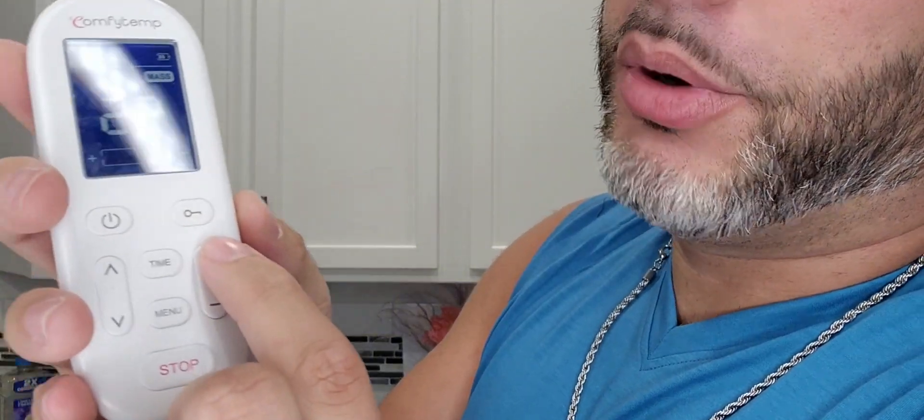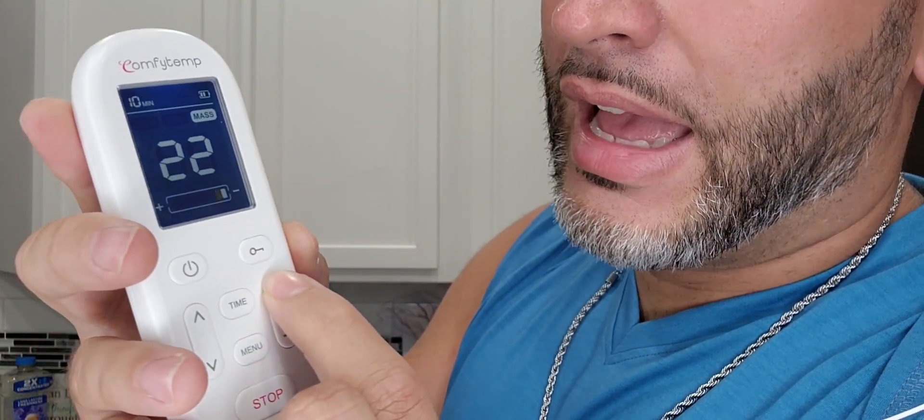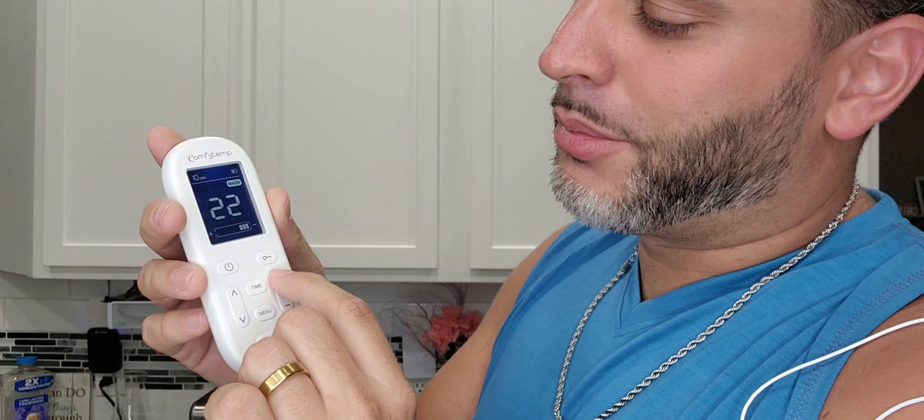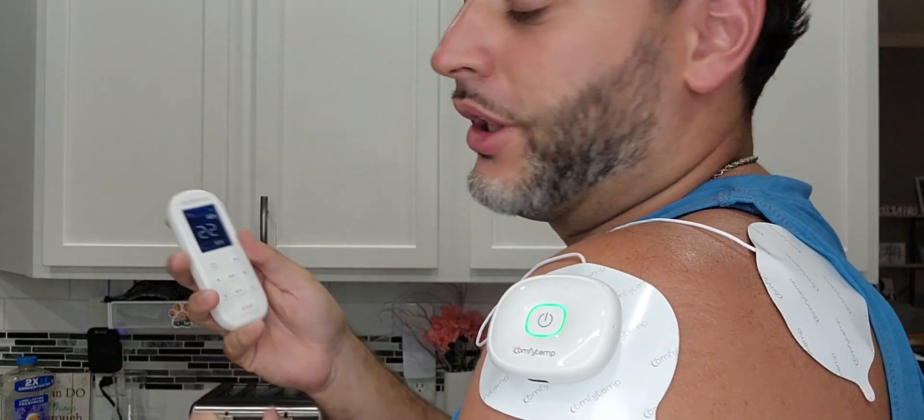Now we're going to hold down that power button. Right away it'll say 'CC,' meaning it's just connected. We're going to do the massage mode — honestly the massage one is definitely my favorite. We'll put up the intensity; I like to leave it at about the third normally. You know, when you go to the chiropractor they tell you to let them know when you want it to stop, once it reaches that intensity. We'll bring it up to about a four — that actually feels really good.